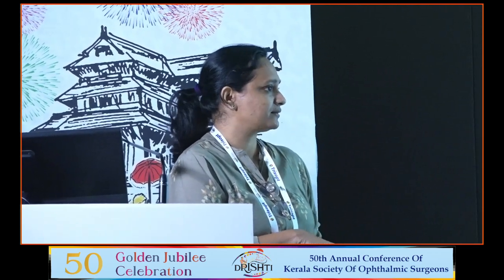In combined surgery, even if you need the cohesive in, I think it won't be a problem, because I usually use cohesive once the cataract is done. Then I put the cohesive viscoelastic to complete my trab, and maybe if I'm feeling it is shallow, I may need a bit of cohesive inside, so that the shallowing will be less.